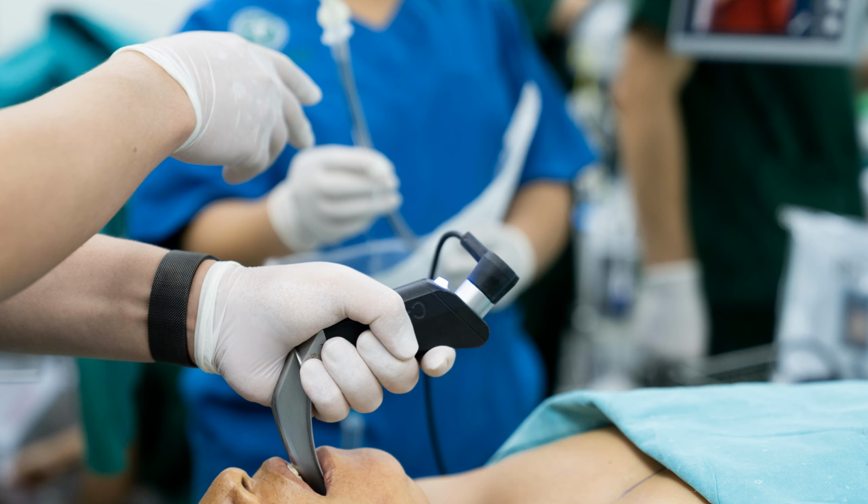So you might be saying, well, if the D blade gives you a good view of the larynx, but intubation might still be difficult, well then why use the D blade? Well, the D blade is the blade that's going to get you out of trouble when you're using a normal laryngoscope and you can't see the vocal cords. It's the blade that's going to make visualization of the larynx possible and then give you a chance of intubating the patient and actually passing the endotracheal tube into the trachea.